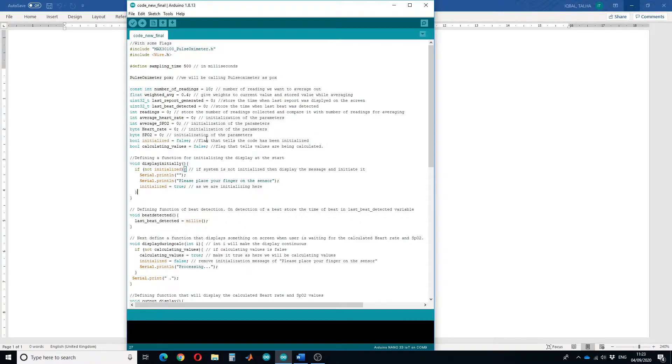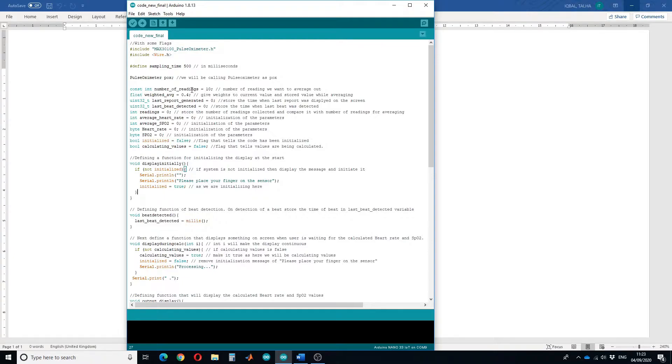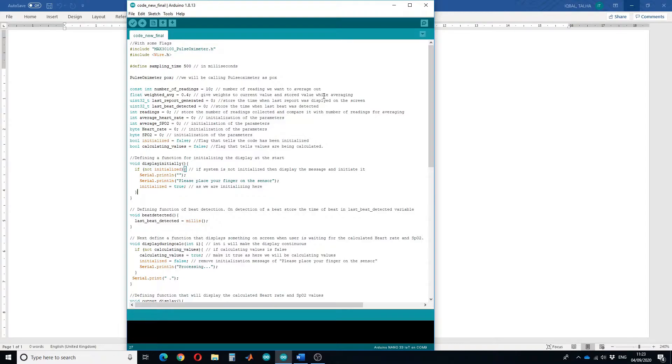I have initialized some variables here. To get a stable heart rate we are going to use averaging technique. Number of readings will be the number of readings which we want to average out, and then we will be doing a weighted average. This will give the weight to the current value and store the value while averaging.